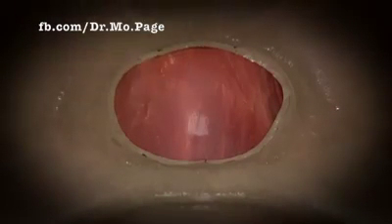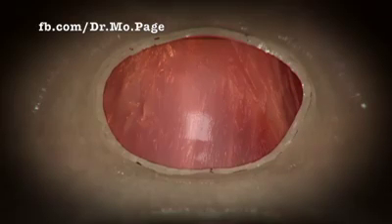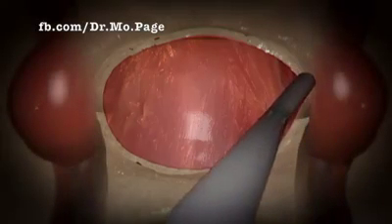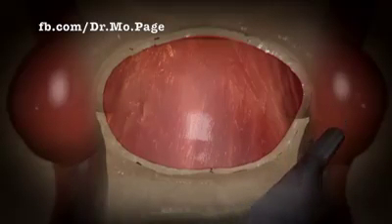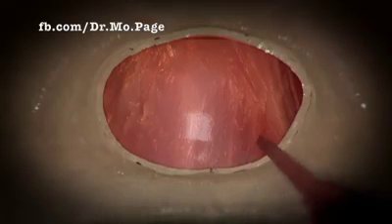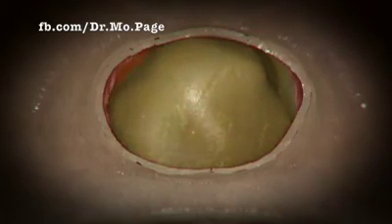Next, the bone of the skull base over the tumor and pituitary gland is removed. Prior to opening the dura, which covers the pituitary gland and tumor, the Doppler probe is used to precisely localize the carotid arteries. The dura is then opened and lifted upward, revealing the pituitary tumor and compressed gland.